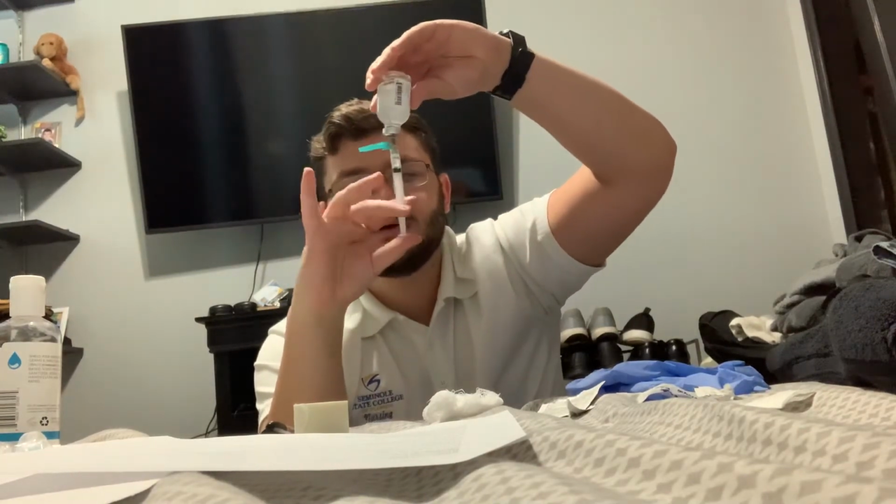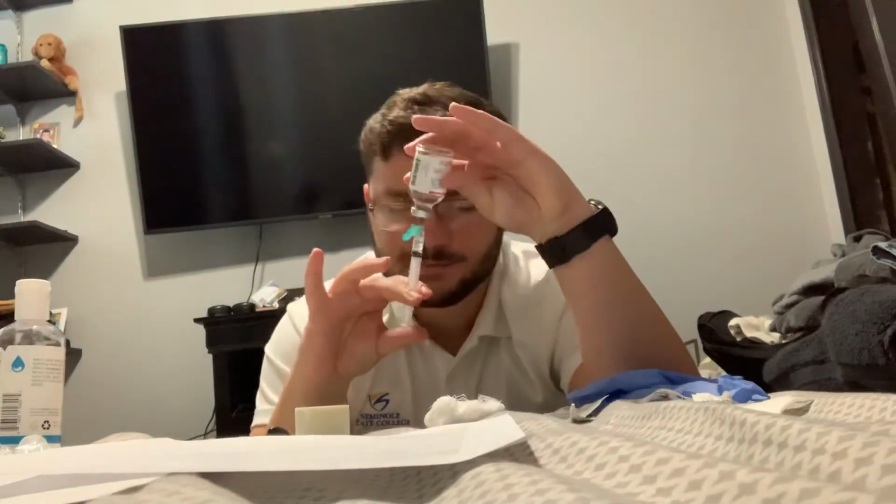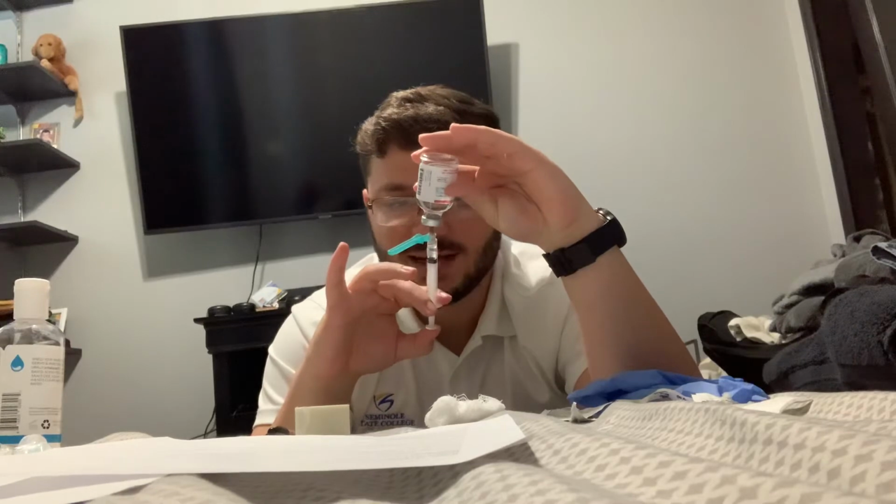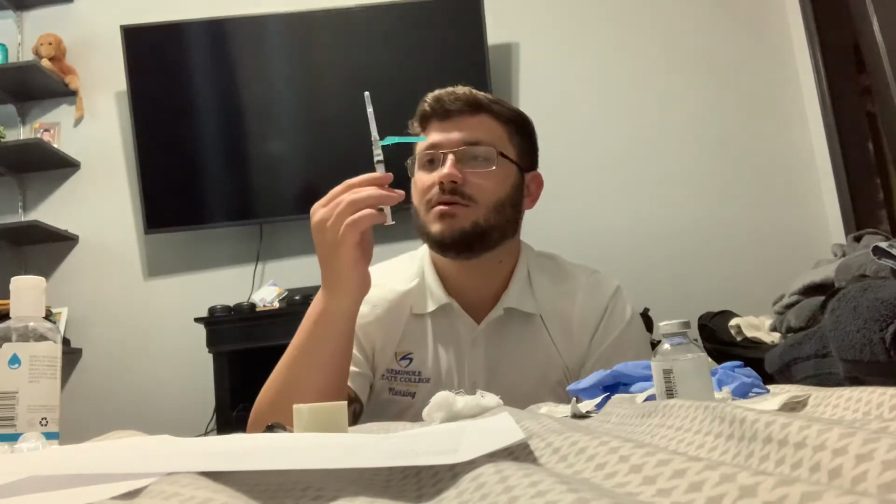All right. So, without touching anything on the inside, I'm going to ensure that I have exactly 0.5 mLs of the medication, which I do. Flip that back over. Remove. Right. So now I'm going to take my syringe and, using the scoop method on the side of the table, ensure that I pick up the syringe without touching and cap it.